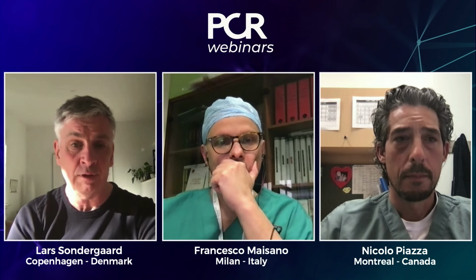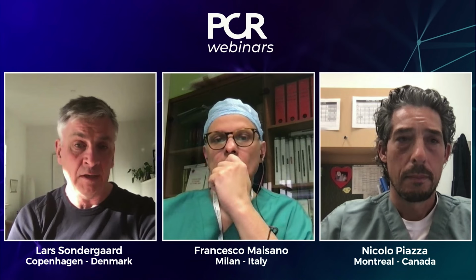Yeah. And also, if you want to do leaflet modifications such as BASILICA, you also have to think about that already from the first valve implantation, because you need to have commissural alignment. Otherwise, it's not going to be very effective. But again, if you're going to treat this patient, we need to think far ahead. It's not only about how to execute a safe procedure today, but also what's coming next when the patient comes back with coronary artery disease or will need a second valve later on. So it's going to be a much more complex decision in treating these patients.